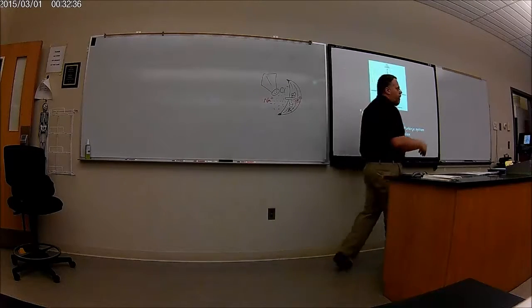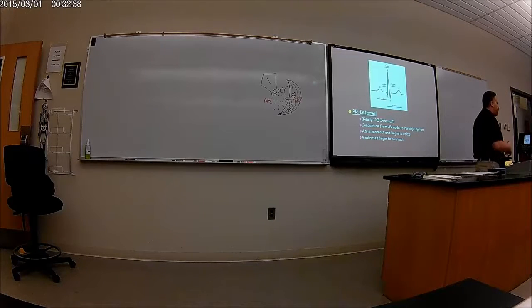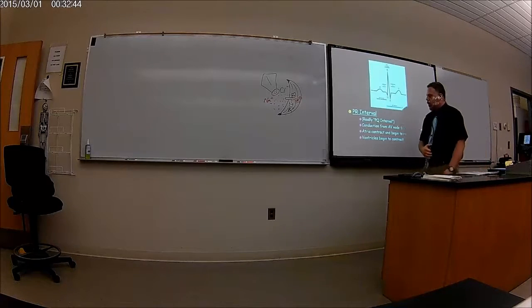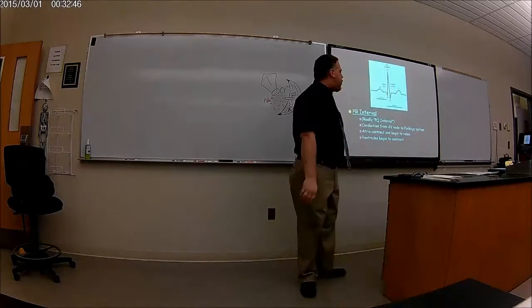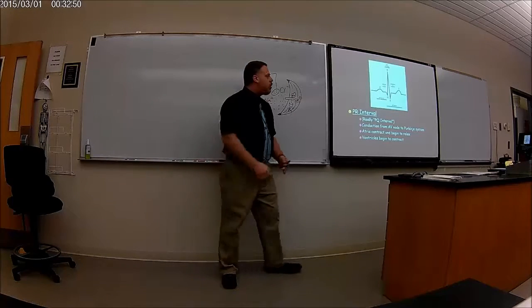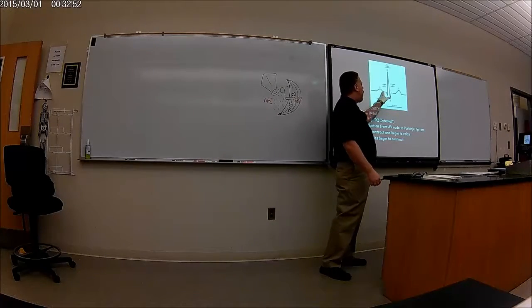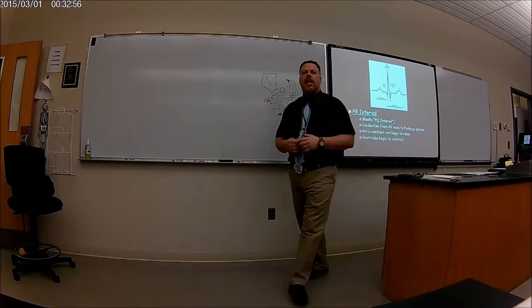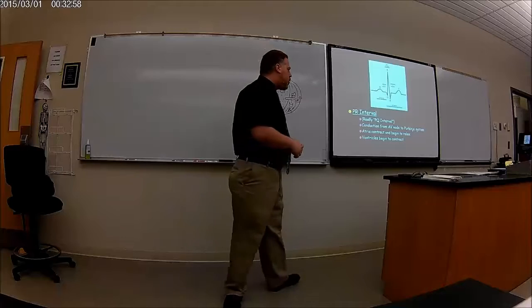This is where we have the conduction, the electricity going from the AV node to the Purkinje fibers. This is where the atria contract and they begin to relax, right? So they're going to be fully contracting here, but they're going to start beginning at the end of the PR. It's going to relax a little, or start to relax.